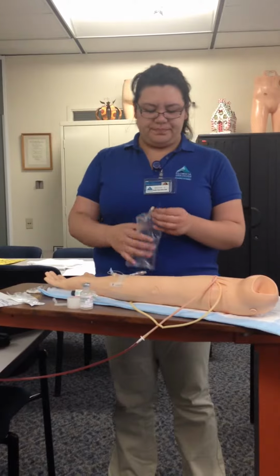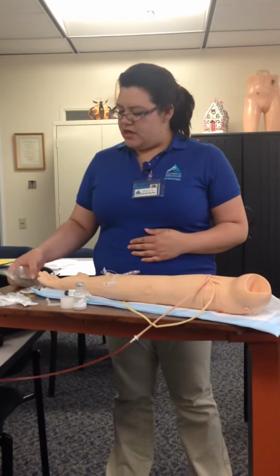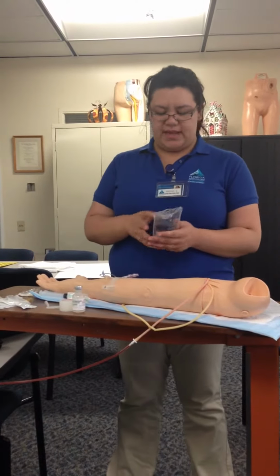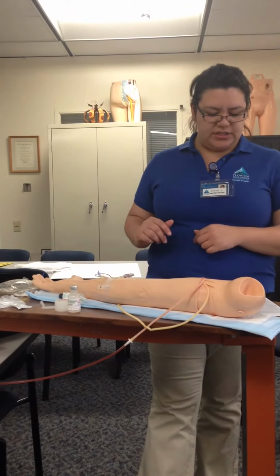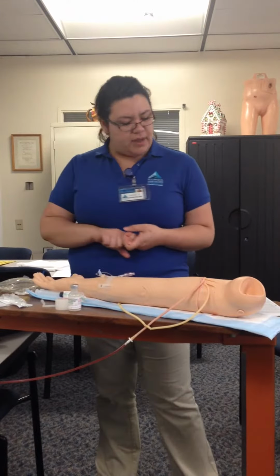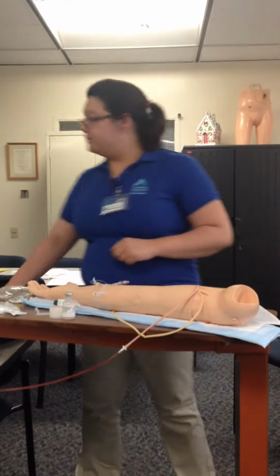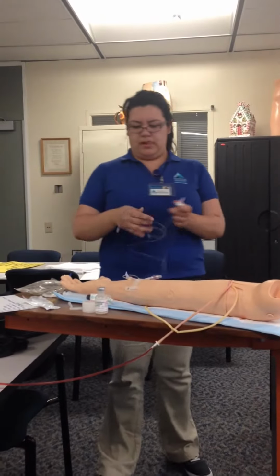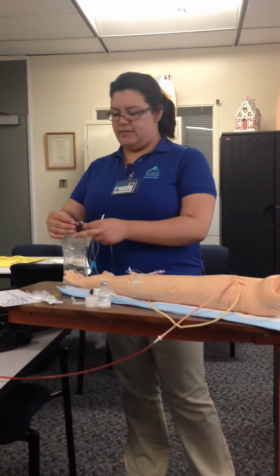I would write on my bag the client's name, the drug, the dosage, the time of the administration, and my initials. And now I will attach the needleless device to the tubing and label the tubing with the date, time, and my initials. So I'm going to attach my tubing to my bag.